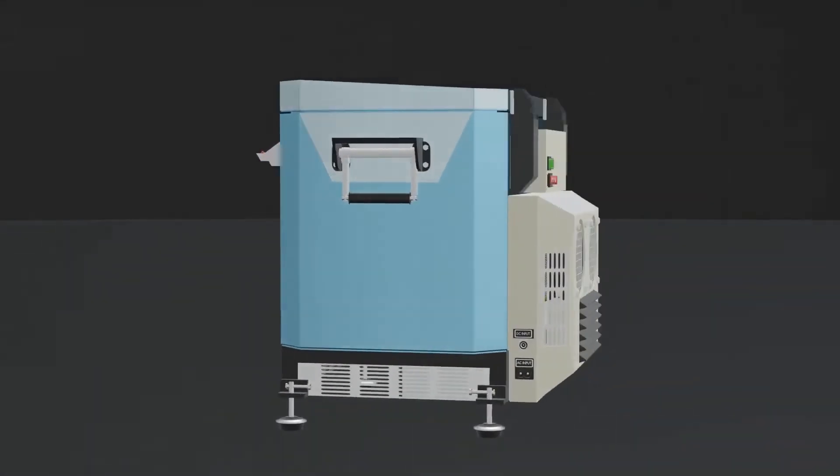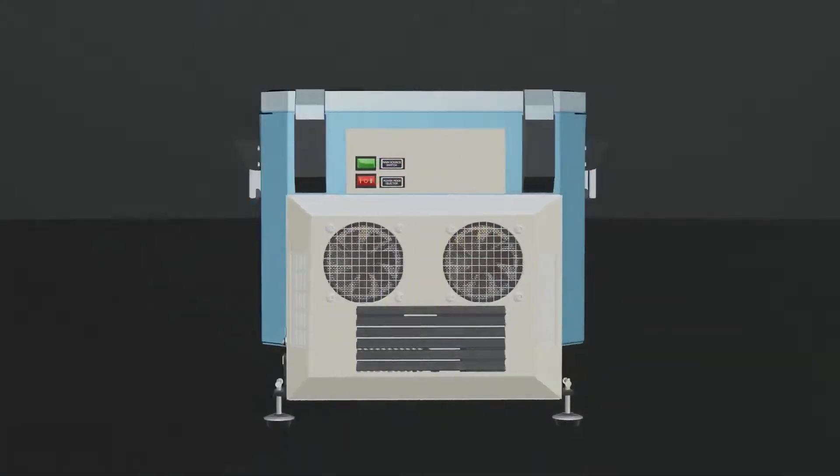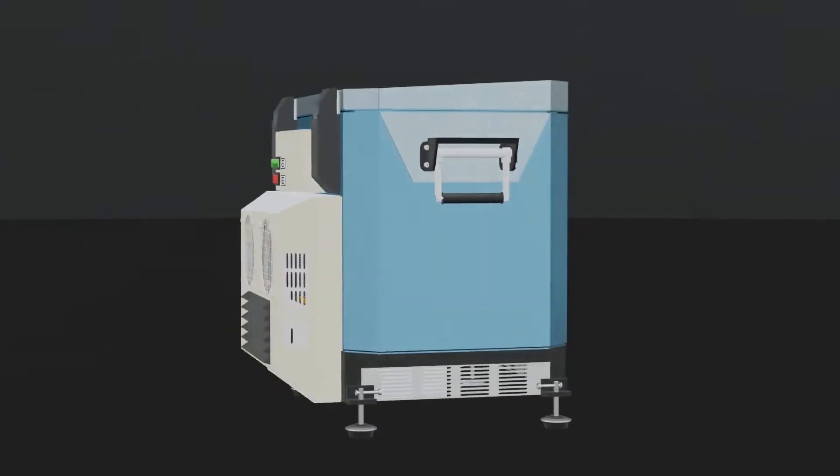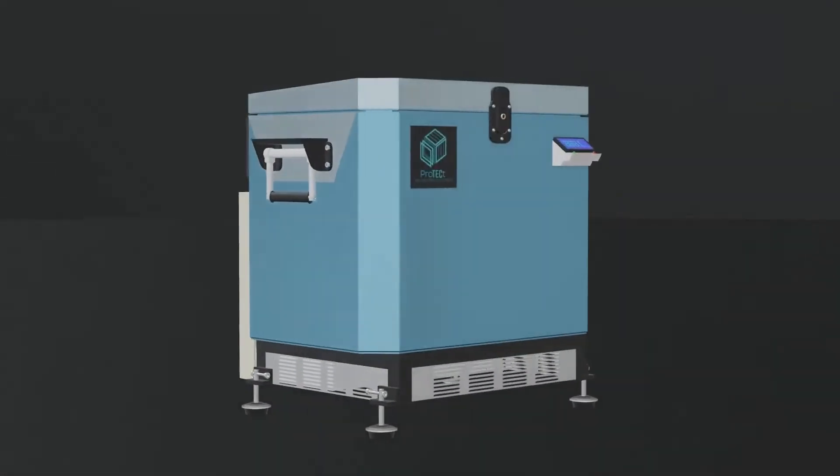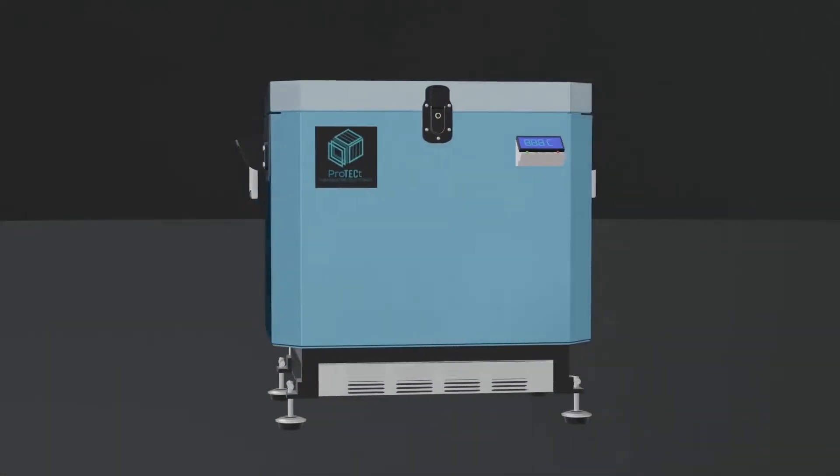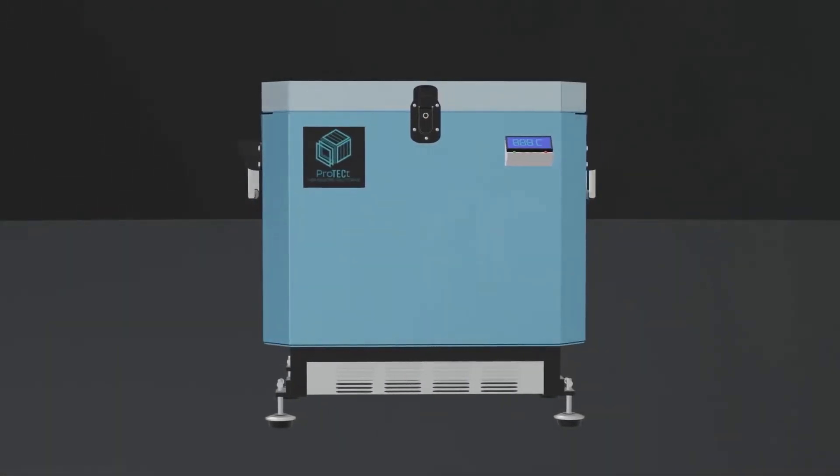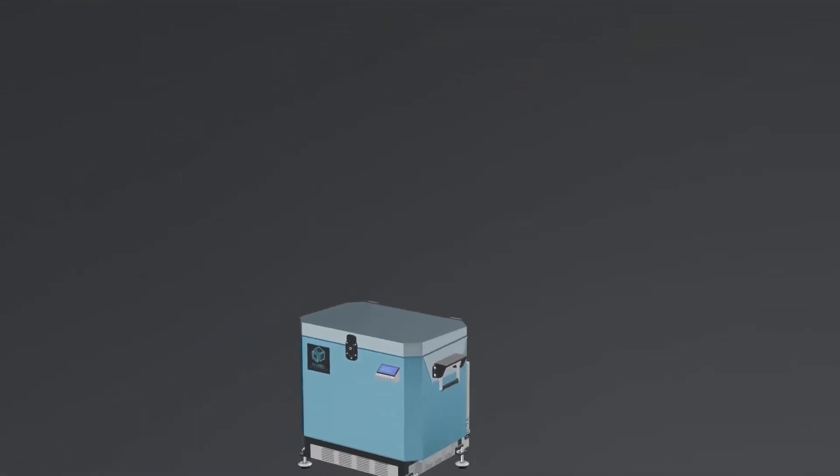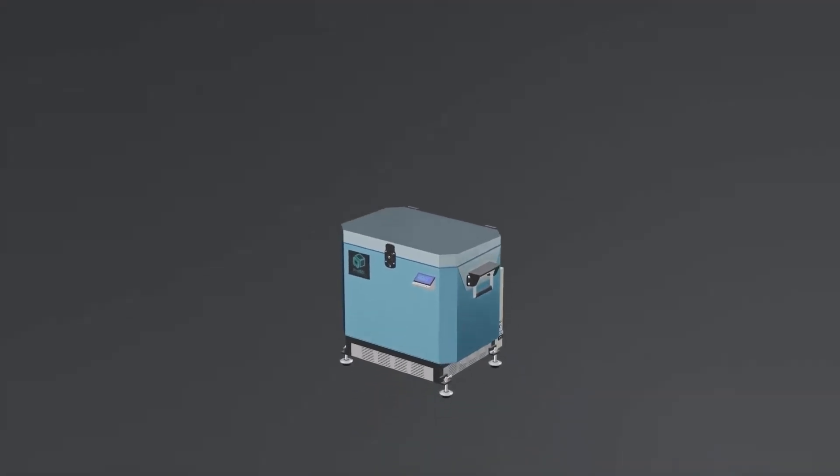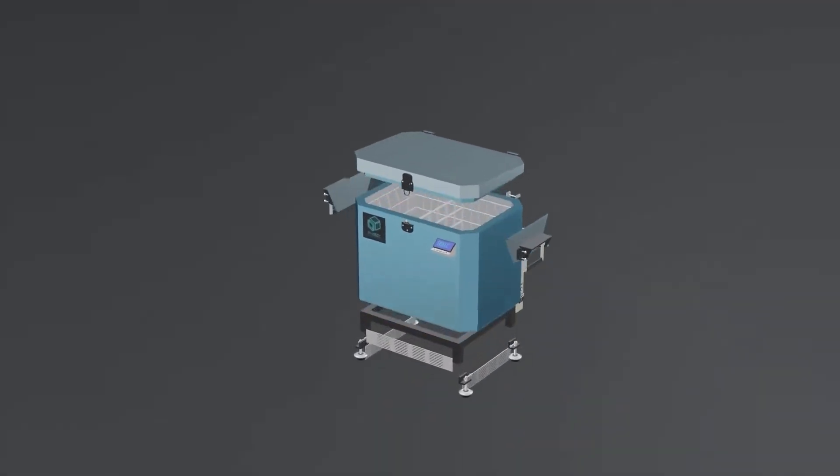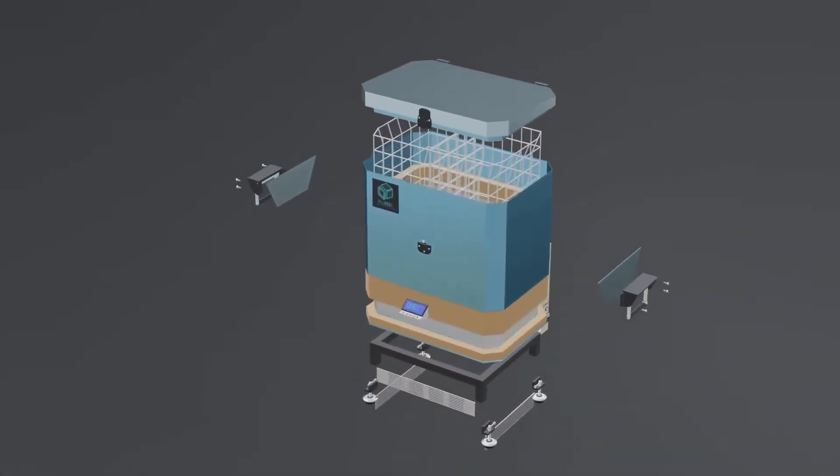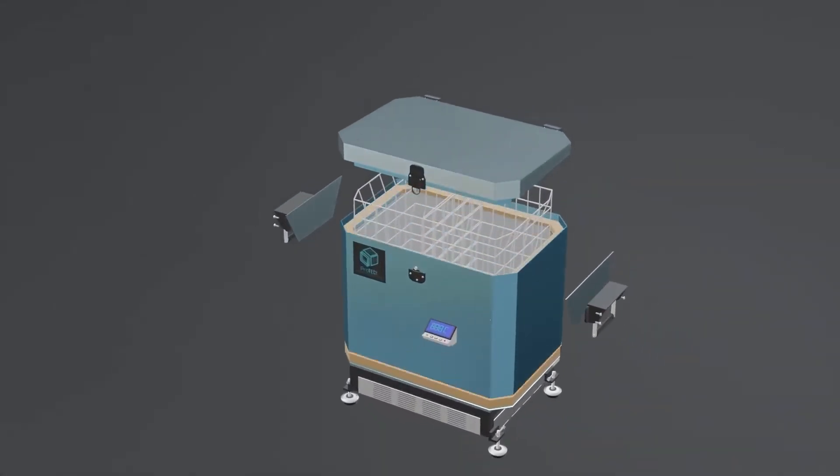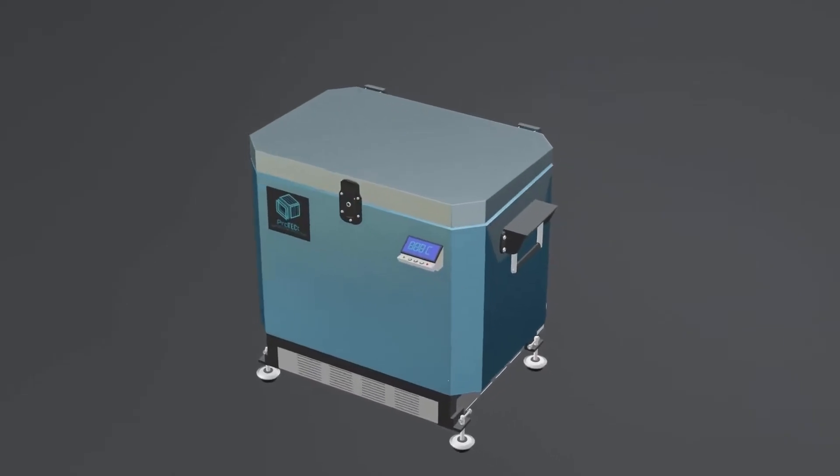This Arduino-based portable cold storage system is positioned in the medical field to transport vaccine vials. The main parts of the system are the thermoelectric Peltier module, heat sink, fan, temperature sensor, and Arduino Uno.